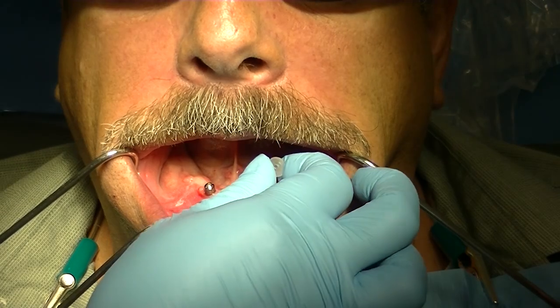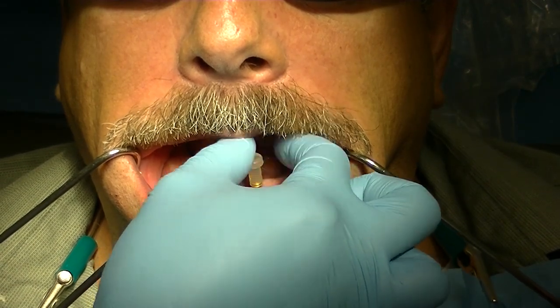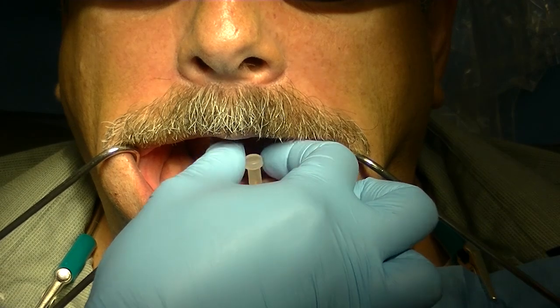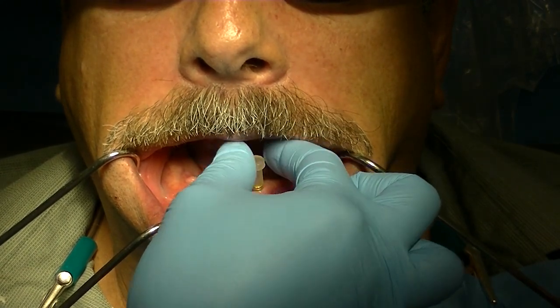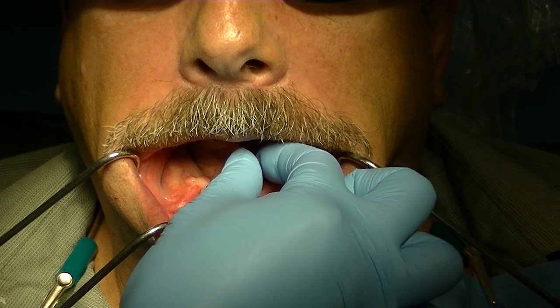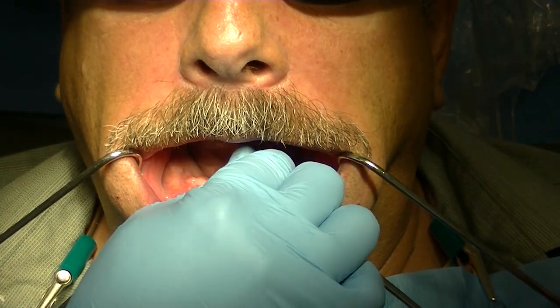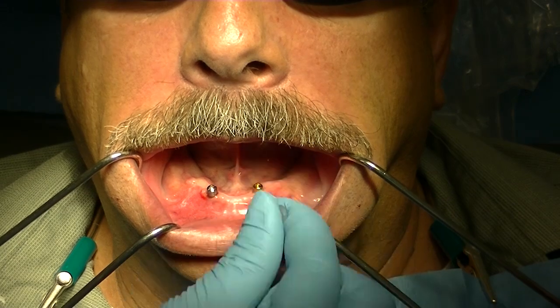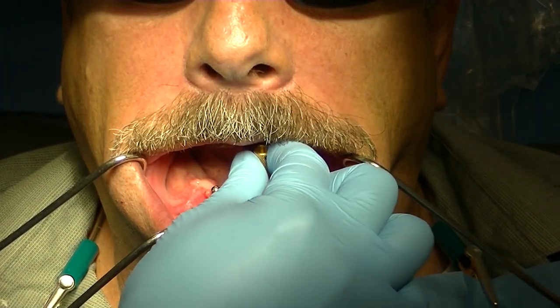I like to go ahead and irrigate each implant with Paradex prior to insertion of my locator attachment. I use the included attachment delivery mechanism with this particular implant brand. I hand tighten the attachment until it's just barely snug. We remove the little delivery cap and then I go in with the core tool and just firm it up with a snug finger pressure.